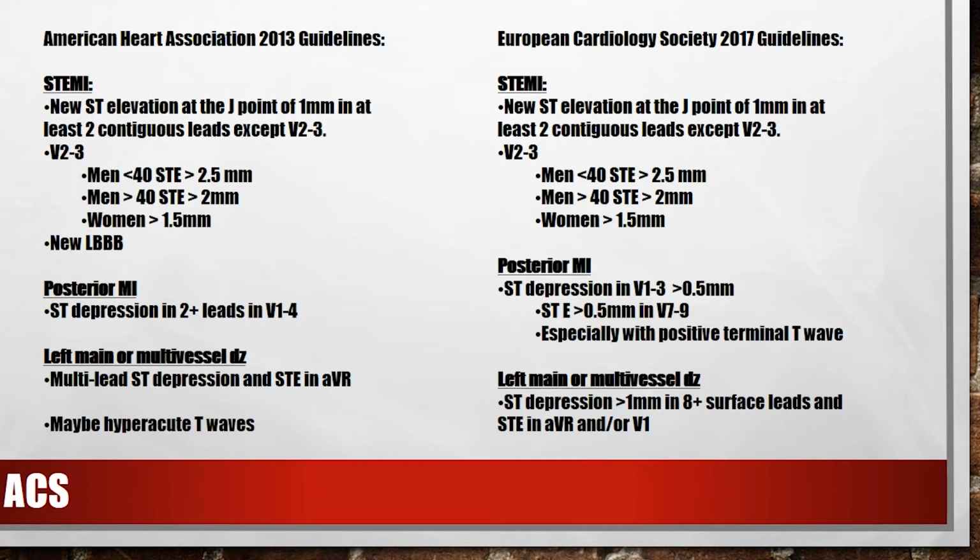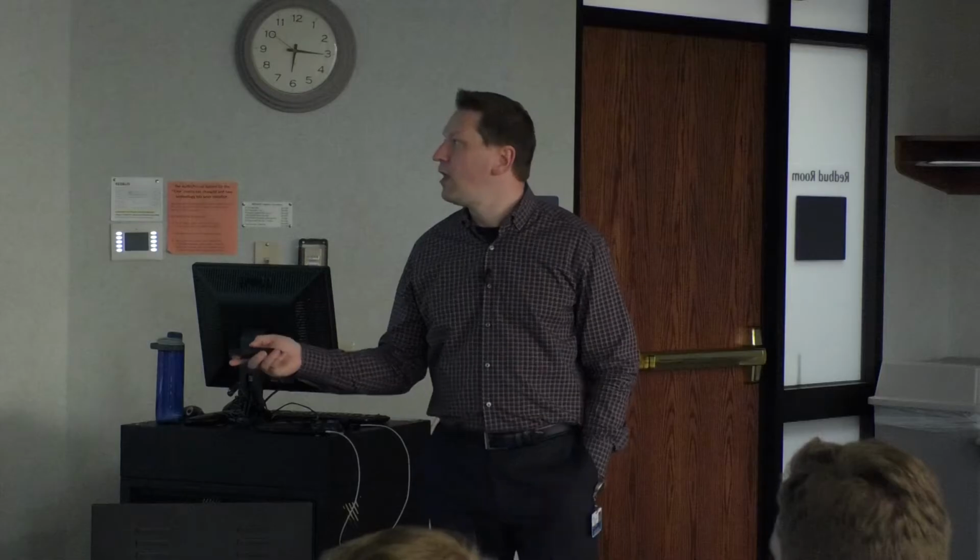There are a couple of notable exceptions. If you have left main disease, you're probably going to have ST depression everywhere, and AVR is going to have ST elevation, real ST elevation, okay? That's a very, very high-risk finding.